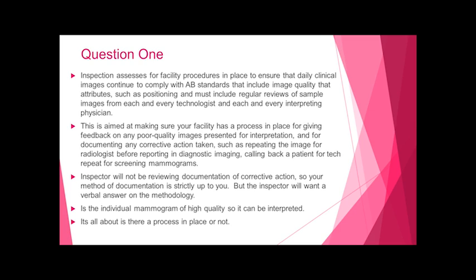Because the inspector says, is there a process or not? And you say, yes, the process is this. It can be any process that your facility wants to use. It doesn't have to be a specific format, which is really nice. They're letting you pick. So they're saying, do you have a process in place if the images are not in accreditation body standard?